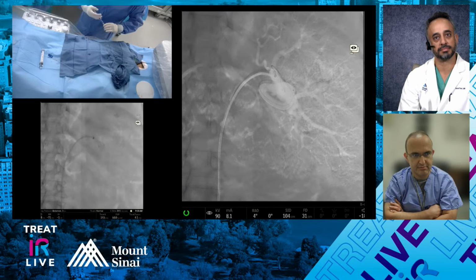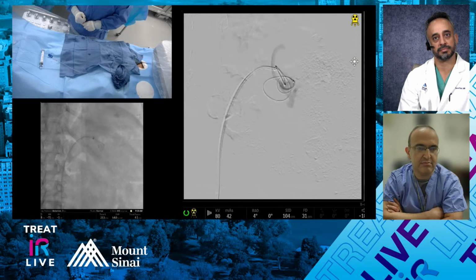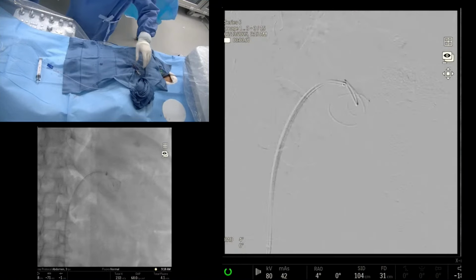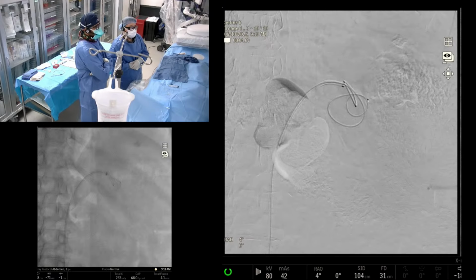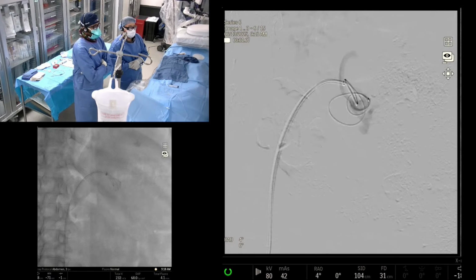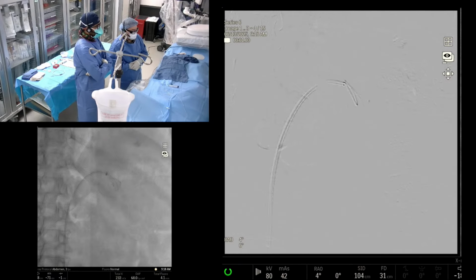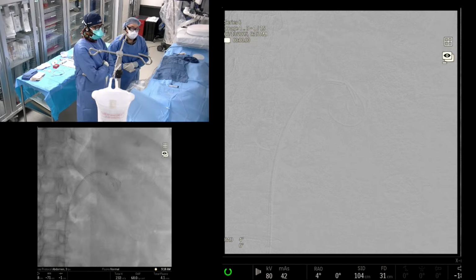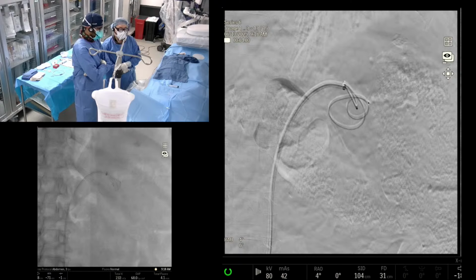Okay, so I am back in the aneurysm sac. As you stated, there's probably more than one outflow here, so it might be more prudent, as both of you have suggested, just to coil the aneurysm sac itself. So we're probably going to start to do that. Let's get a coil somewhere around the size of 20 millimeters, the longest that you have.